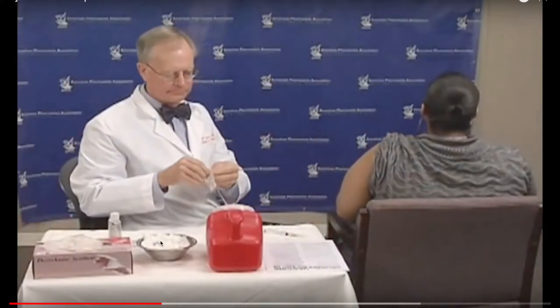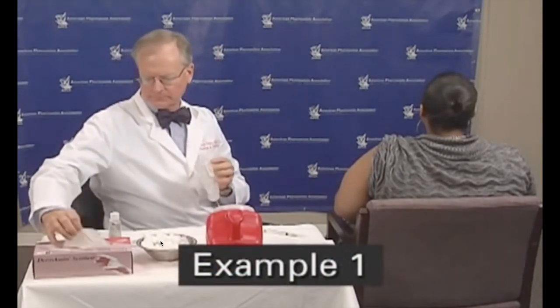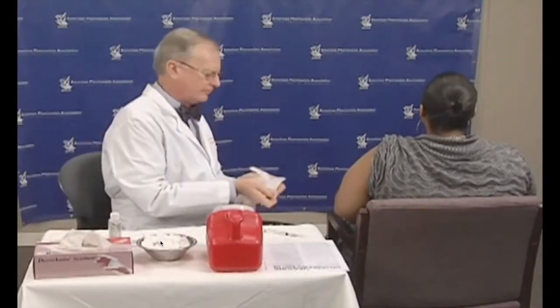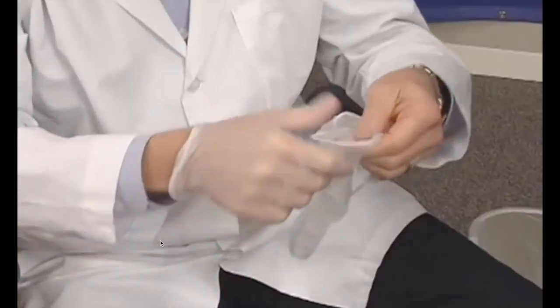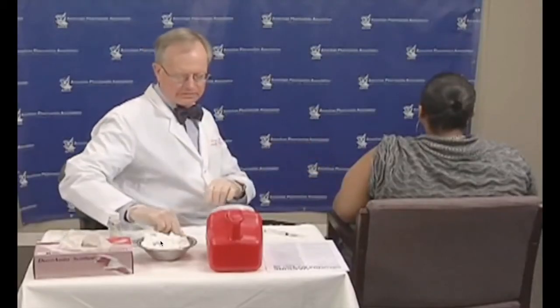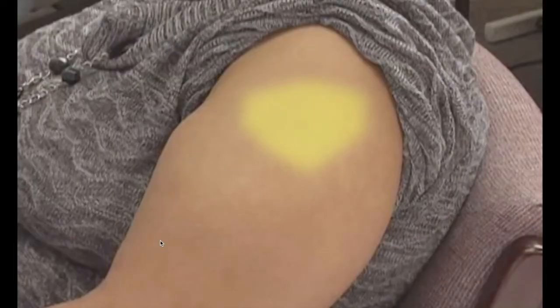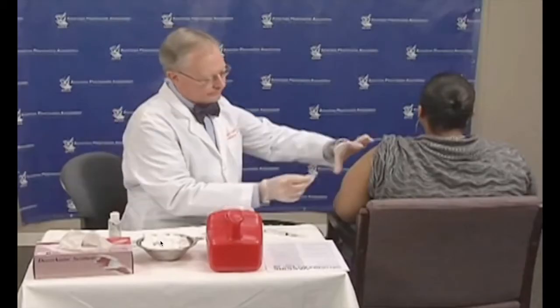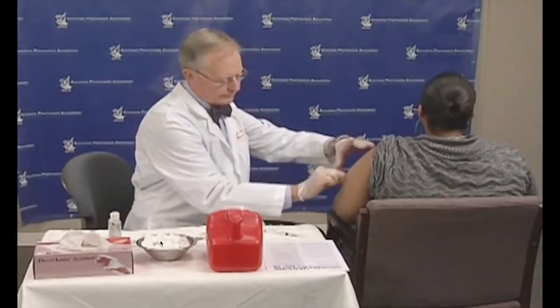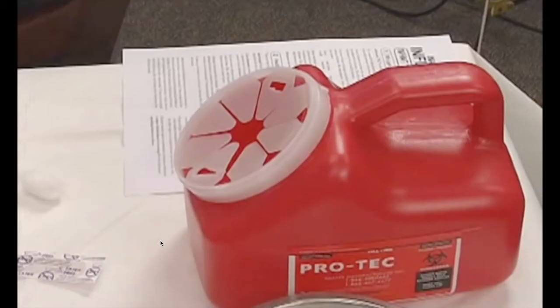Here's a video so that you can recap on how that whole process should look like. Once you're ready to inject the vaccine, proceed as follows. Although gloves are not required, it may be prudent to use gloves for your protection and patient perceptions — follow your local standards. Be sure your patient is sitting. Expose the injection site, which is the thickest and central portion of the deltoid muscle. Swab the injection site with alcohol and allow the alcohol to dry. Note that the sharps container is readily accessible.